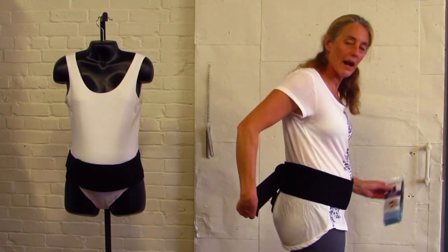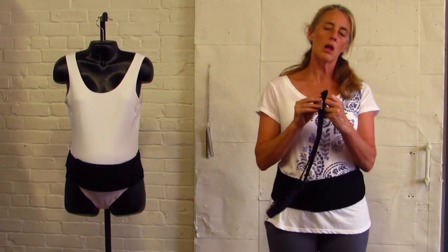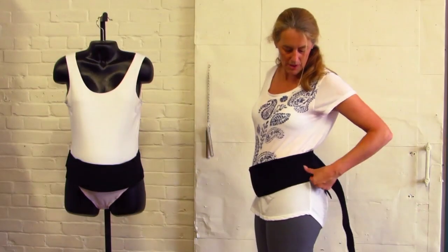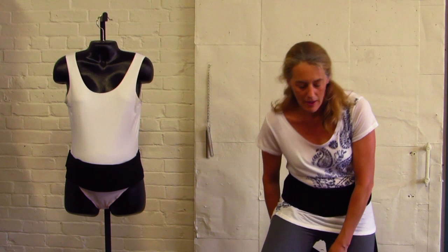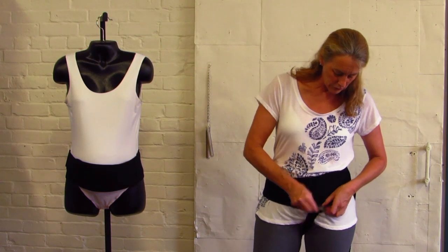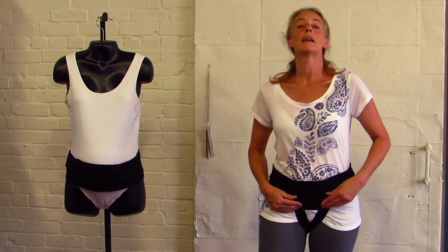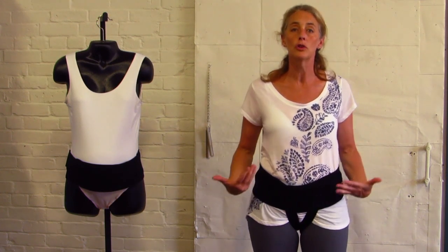Now I'm removing these so that I can put the groin bands on next. Your groin bands are two straps, and what you're going to do is secure them above your hip on one side and above your hip on the other side. They don't have to be removed again once you have them in place. Take them underneath your legs and criss-cross them — the right side comes toward the left, and the left side comes toward the right. You can increase or decrease your compression support depending on what feels good to you.